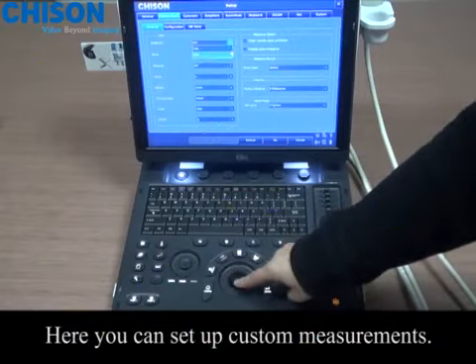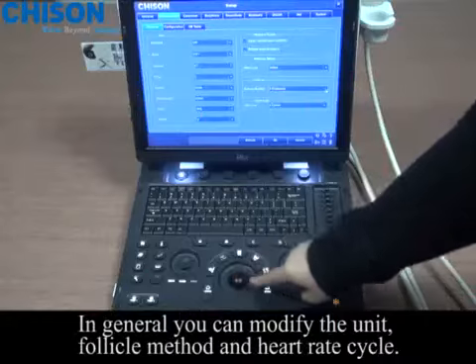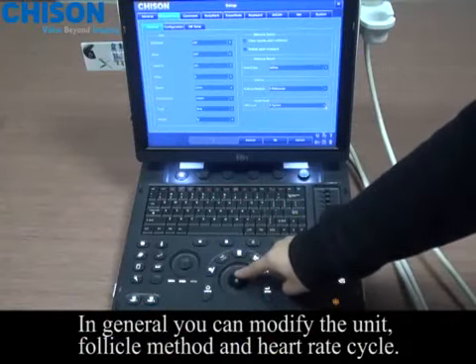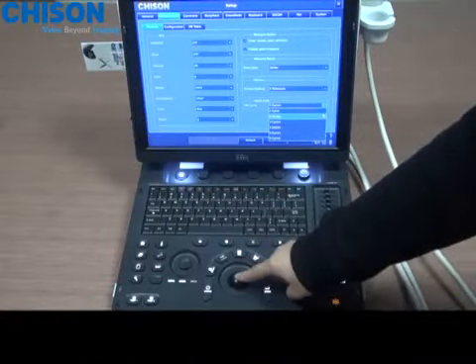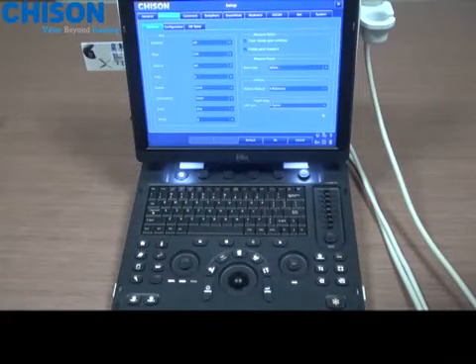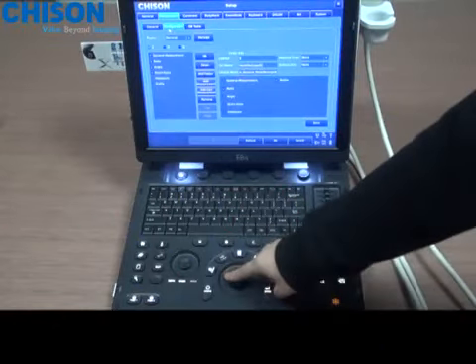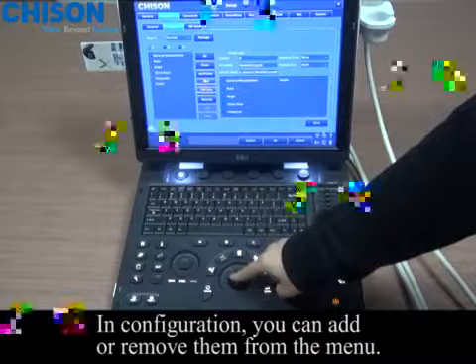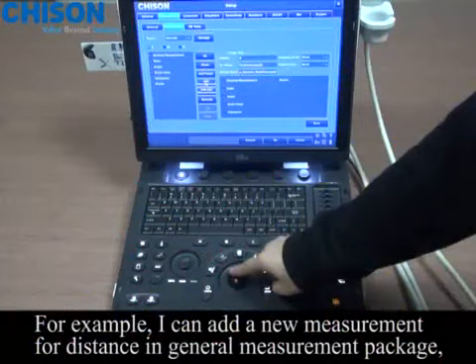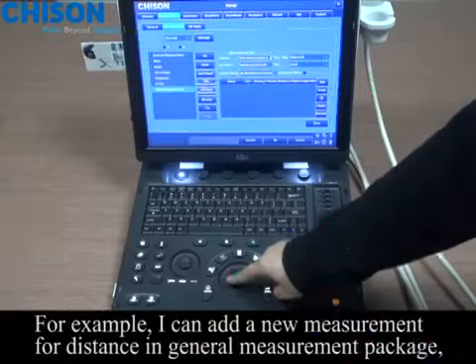Here you can set up custom measurements. In general, you can modify the unit, follicle method, and the heart rate circle. In configuration, you can add or remove them from the menu — for example, I can add a new measurement for distance in the general measurement package.